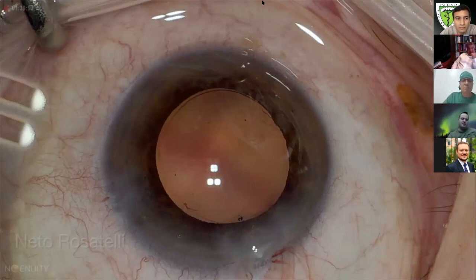Can I comment on that? Sure. Let's first say that the surgery was really good. The only thing that I note, and Dr. Neto also acknowledged it, is that he went out from the AC without putting viscoelastic to protect the posterior capsule rupture from enlarging.